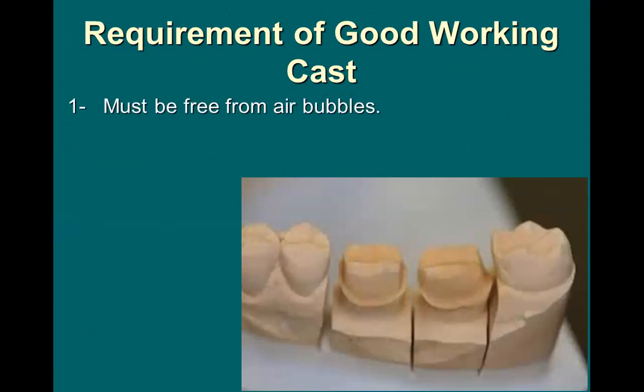So our pouring of the gypsum material inside the impression must be done in a way that the gypsum material will not entrap any air bubbles inside it. When you look at this picture, you see that the dies, or the parts which represent the prepared teeth, have no air bubbles within the gypsum material.